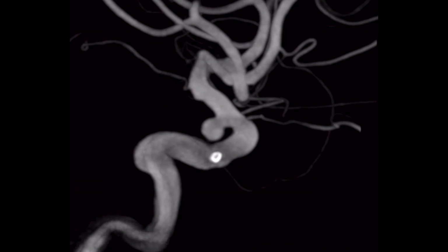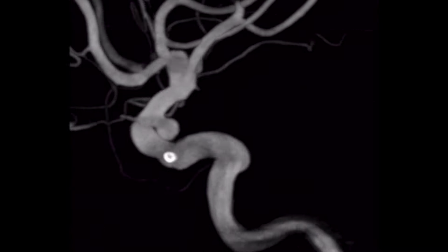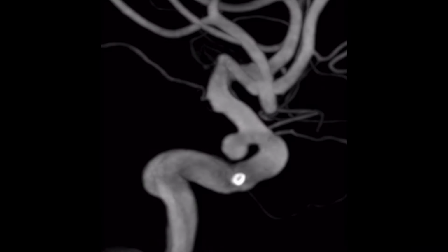And here we have the 3D angiogram, and as you can see, it's a saccular aneurysm, which can be treated in many ways. For example, pure coiling, balloon-assisted coiling, Comaneci-assisted coiling, flow diverter. It can be treated with a web device, so choosing a way to treat this aneurysm doesn't mean that the other ways are wrong. Our plan is very simple. Just navigate the aneurysm sac with a microcatheter and implant the contour device.